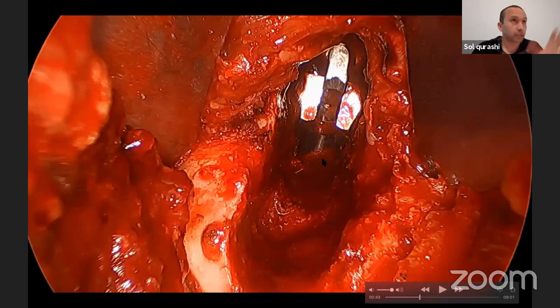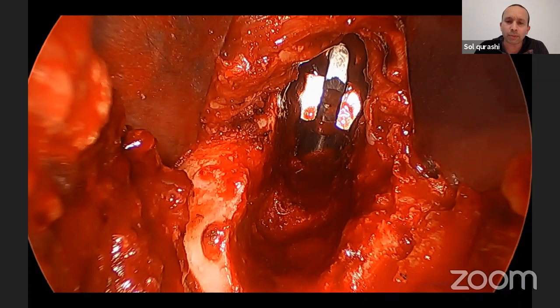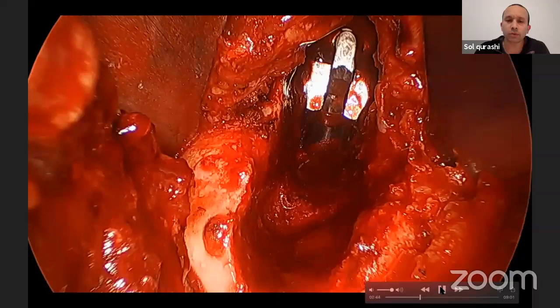So the broach is in, say size 5. If I get the feel that I'm at the right size, once I get that broach in, I'll get an X-ray at this point. I haven't done the neck osteotomy, and the X-ray will show me that I think I can go a bigger size, or hey, you know, this is not going to subside. It's got cortical purchase, so I don't need to do anything further. So after I've done that, that diathermy is just showing my femoral neck anteriorly and posteriorly.